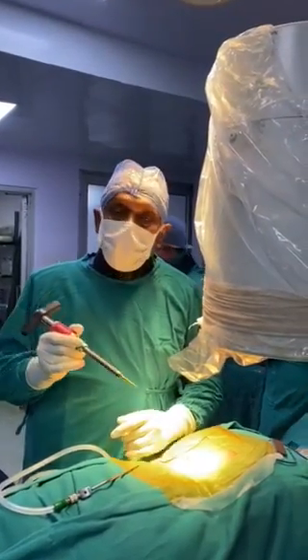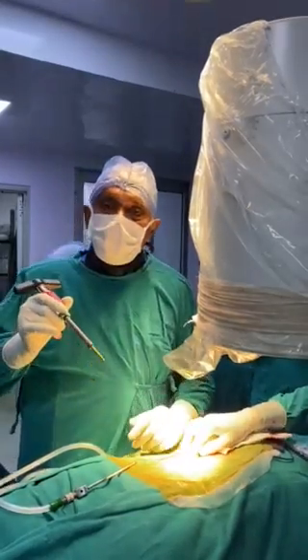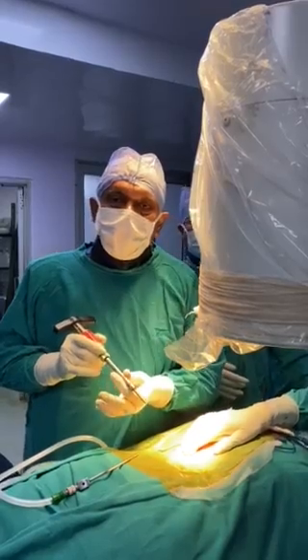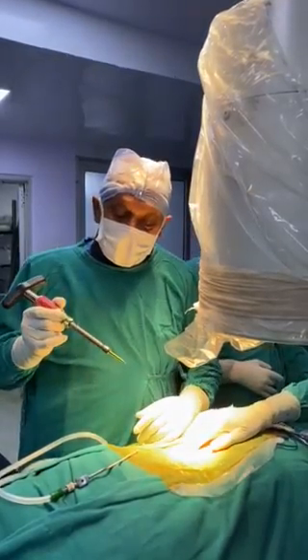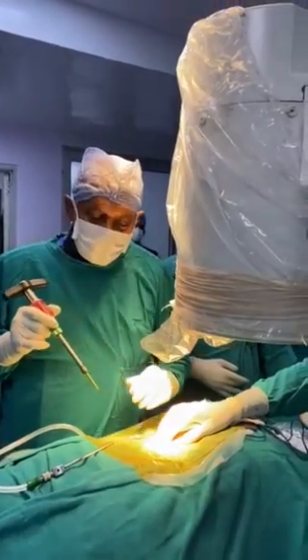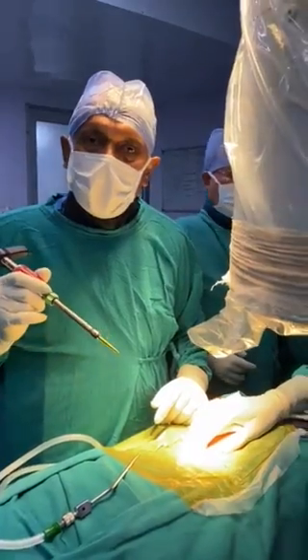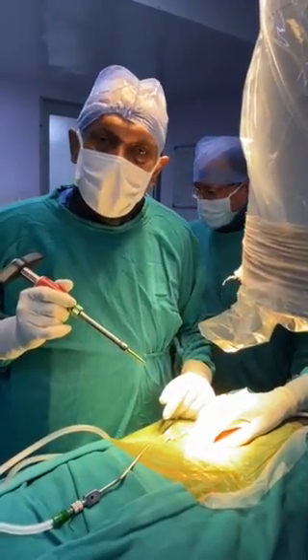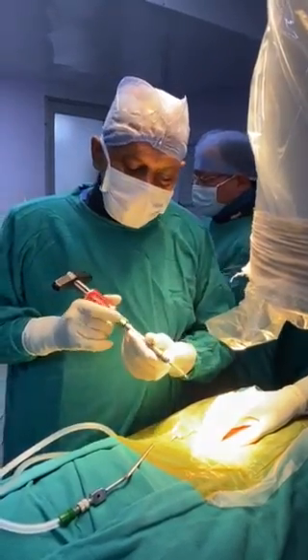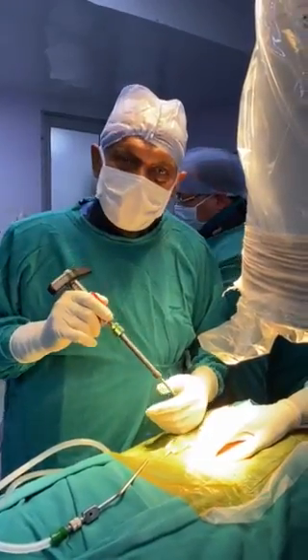Today I am going to do a spinal fusion using the latest percutaneous pedicle screw system by DePuy. This is called the Viper Prime. The beauty of this system is that we don't require a Jamshidi needle or a guide wire, and we don't need to prepare the pedicle — just with a single assembly we can straight away go inside the pedicle.